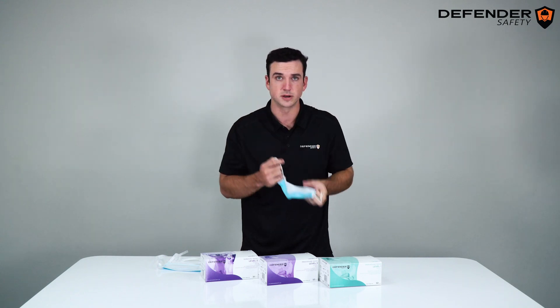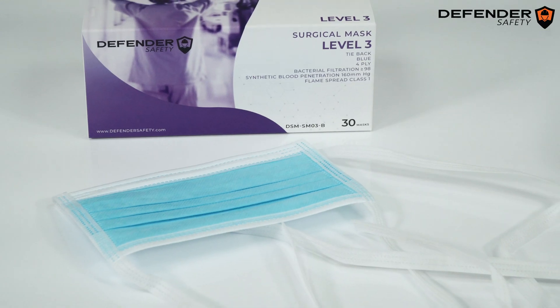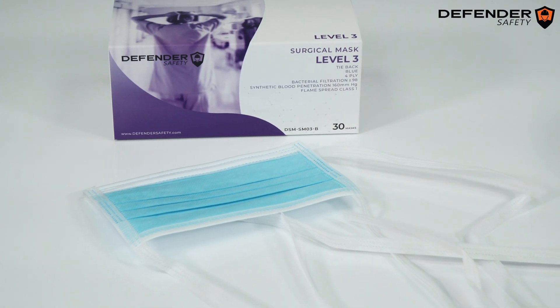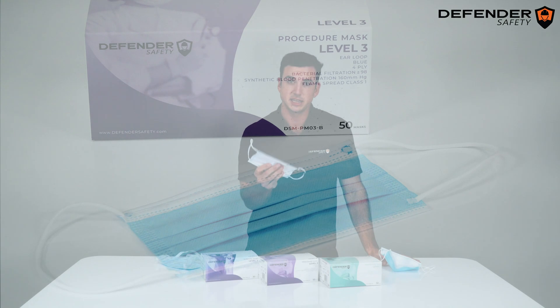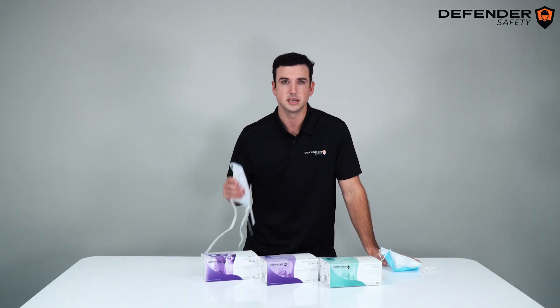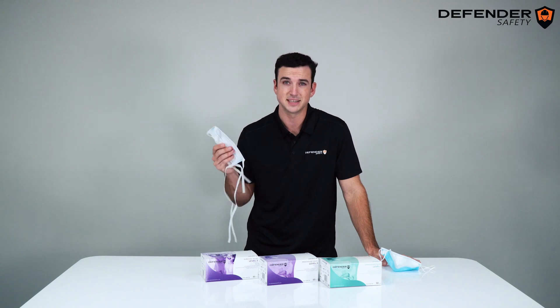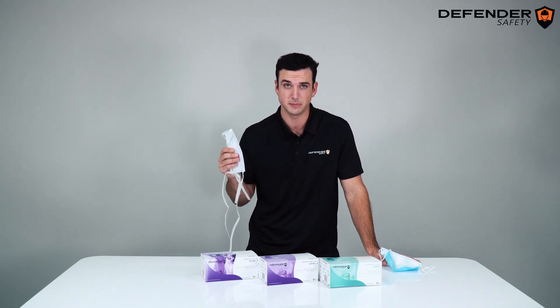Now let's move on to our DSM Level 3 masks, which are available in a tie-back for the surgical style, as well as ear loop for procedure style. As you can see here, this is our procedure version, and this is our surgical version. The extended ties provide comfort if the user has headgear or other additional PPE on.